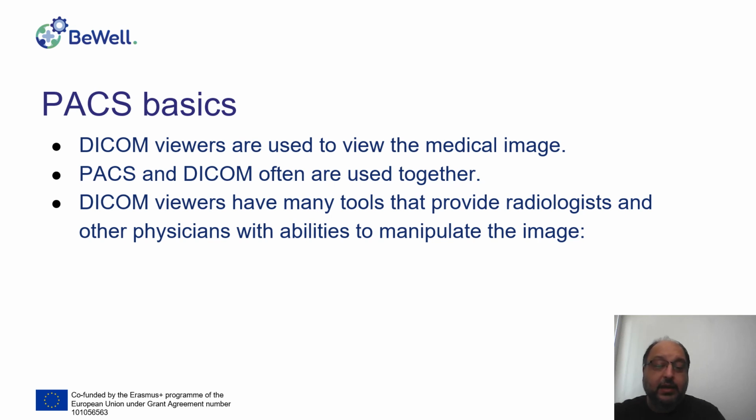I mean, DICOM viewers, of course, have many tools that provide the radiologist with the ability to manipulate the image. And in this sense, manipulate is not used as something to deceive or something in a bad meaning. Manipulate means just to process the image in such a way to have it better or easier to understand.